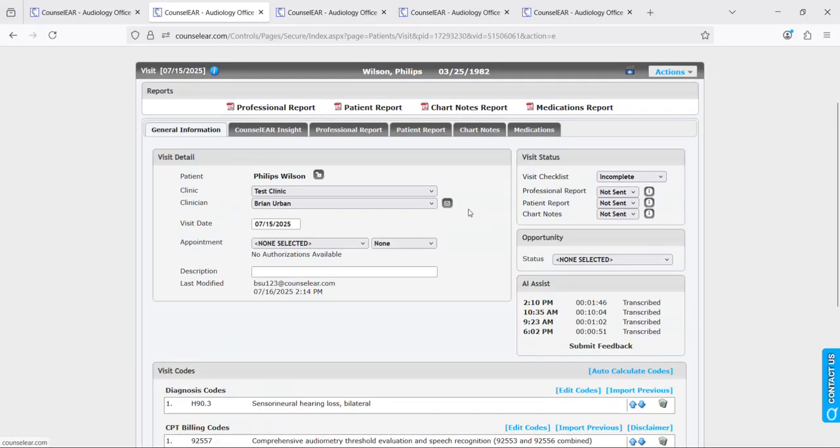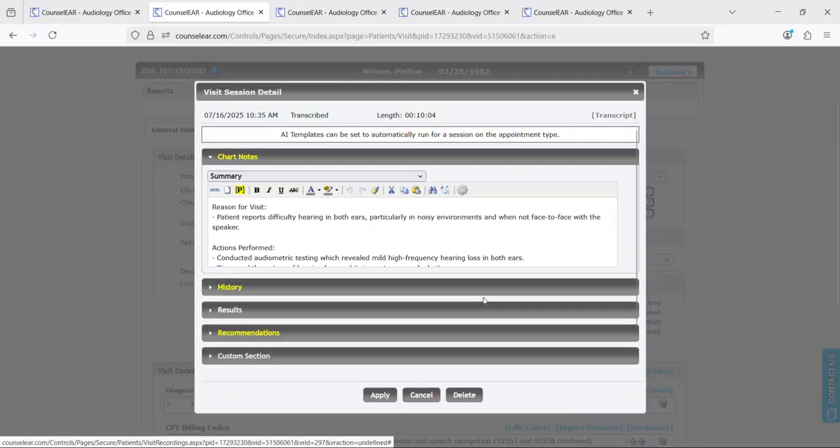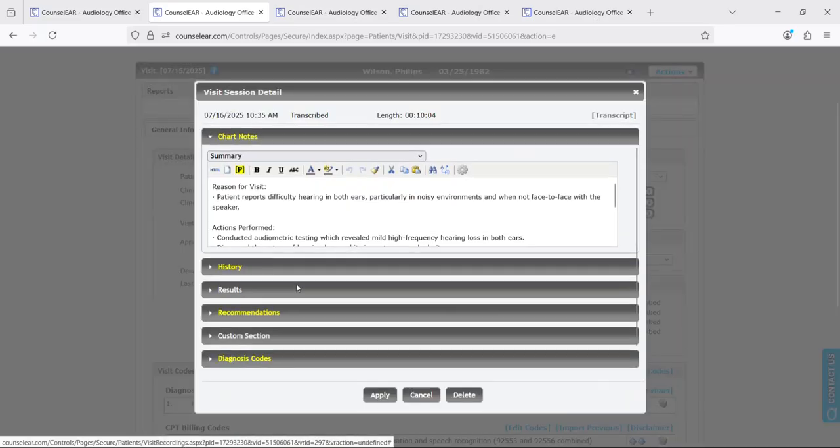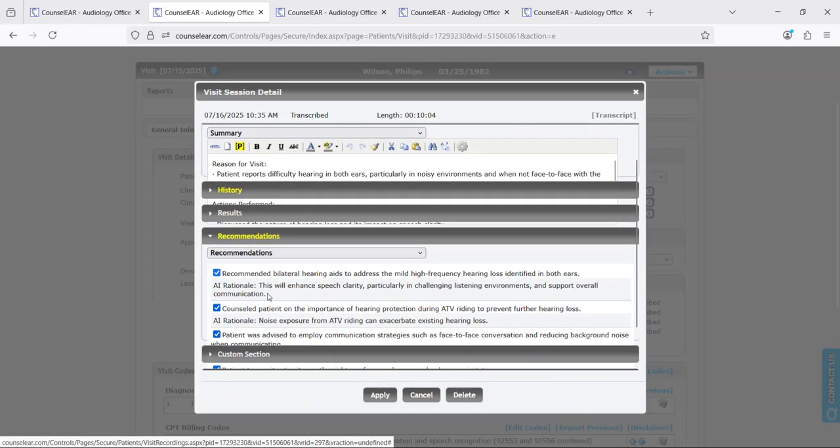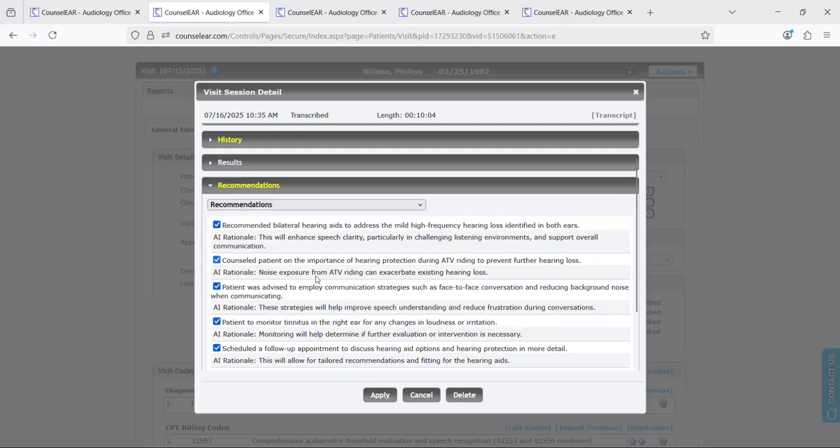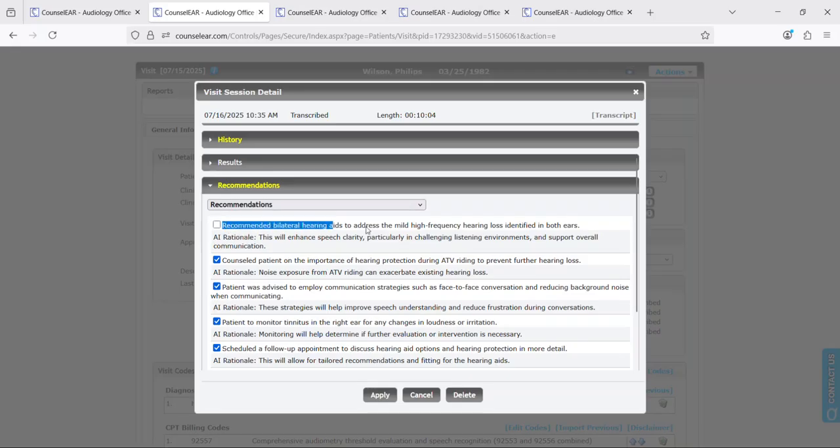I didn't generate a result section but here are the recommendations. Recommendations in particular by the way will give you some information as to where that recommendation essentially came from.